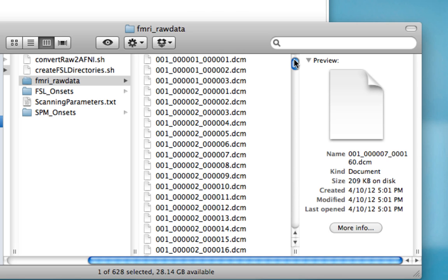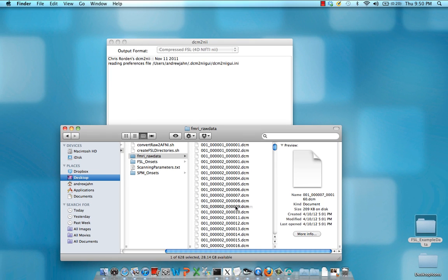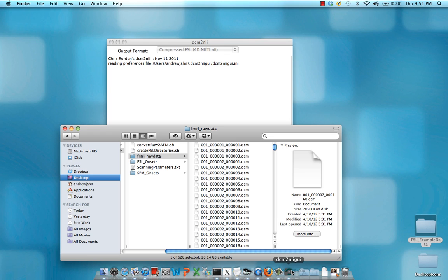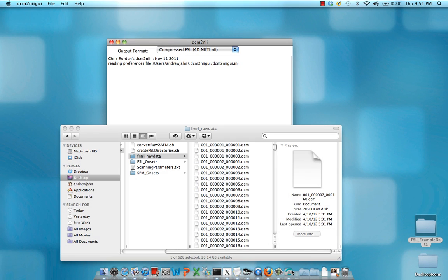Once we're done with that, we can select any of these images, literally any one of them, and click and drag it over to this icon, the DICOM to NIFTI GUI icon in the dock, and release it.